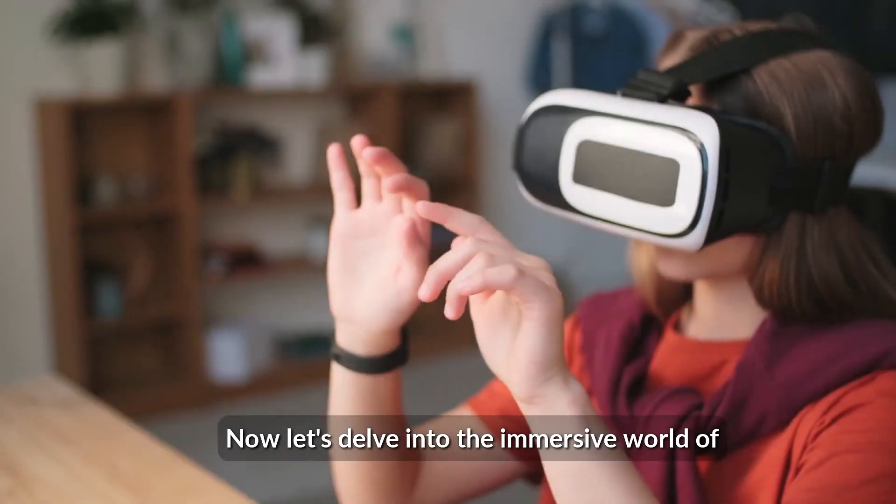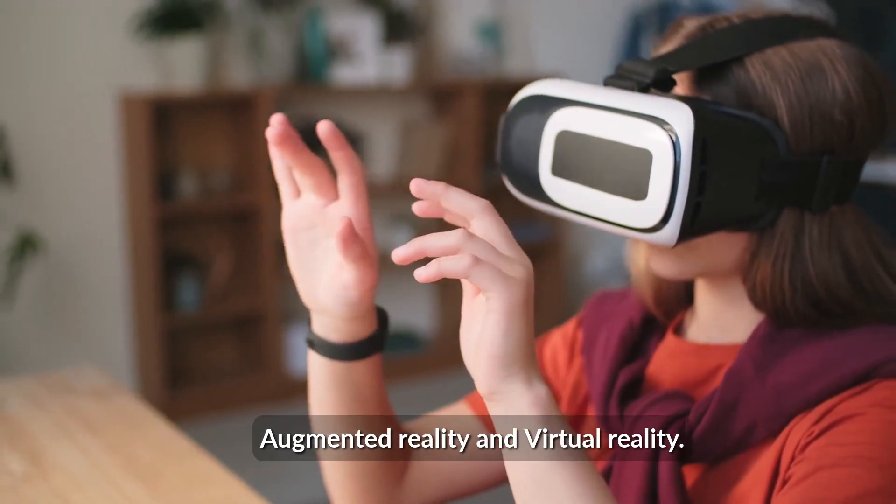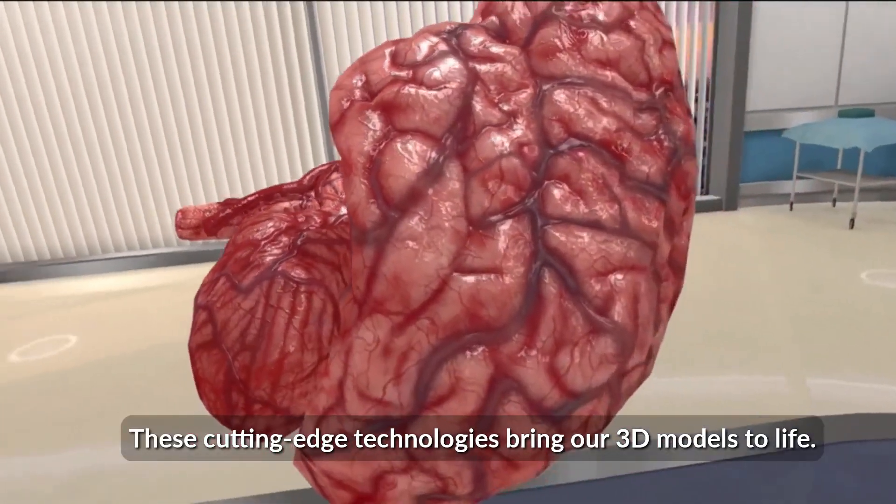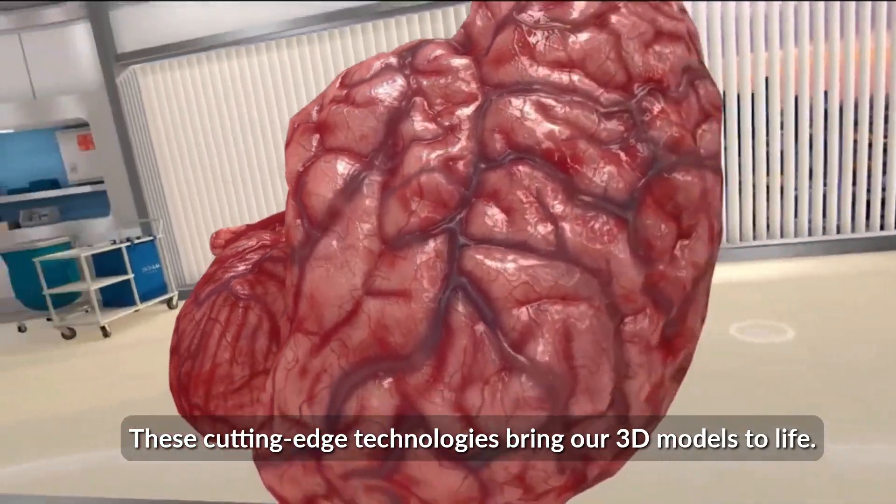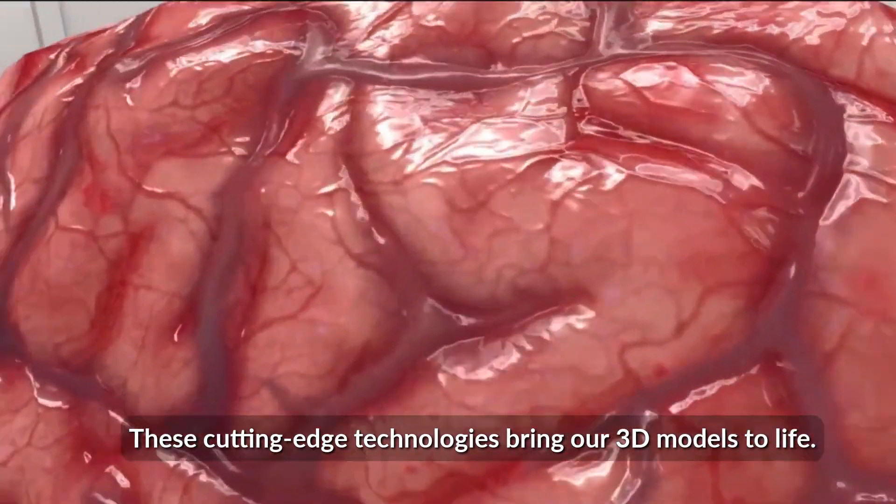Now, let's delve into the immersive world of augmented reality and virtual reality. These cutting-edge technologies bring our 3D models to life.